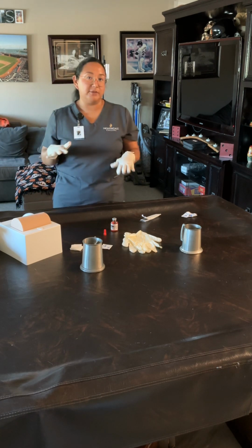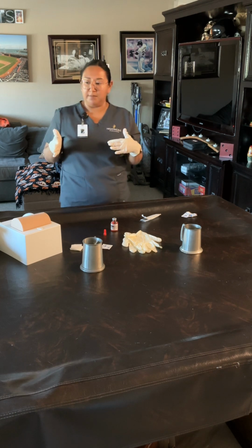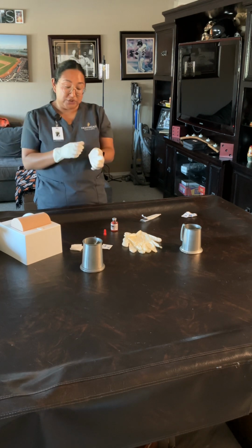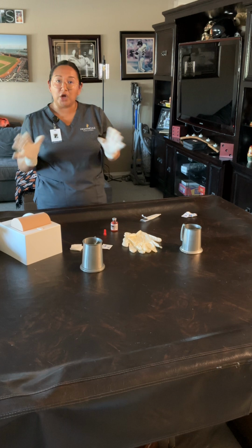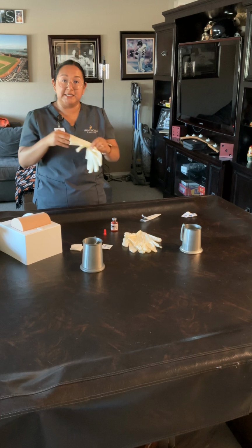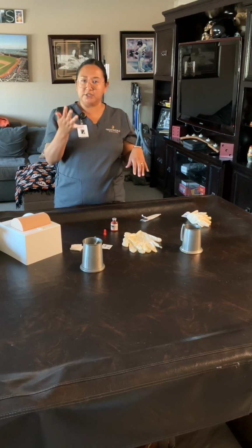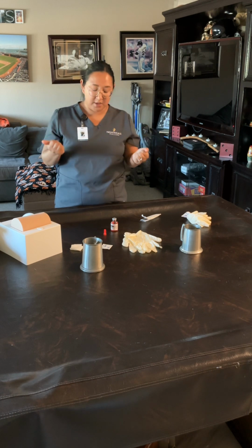I can talk to them for a little bit just to make sure they're okay after the injection. I know some people can get common reactions, and I will ask them to let me know if those common or adverse reactions happen because I need to know immediately. And then next I will clean up my site. I will document everything. I will make sure that I did the right dose at the right time, the right medication, right patient, right documentation, and right route as well.